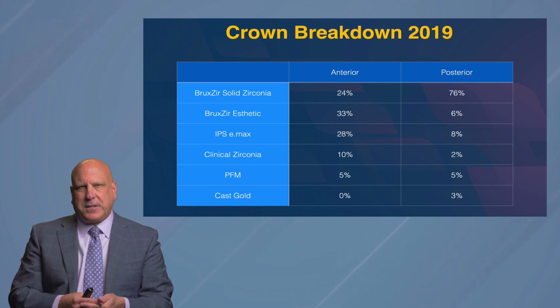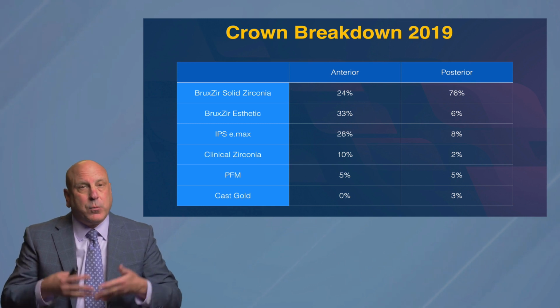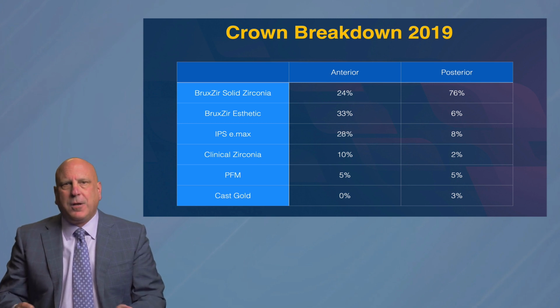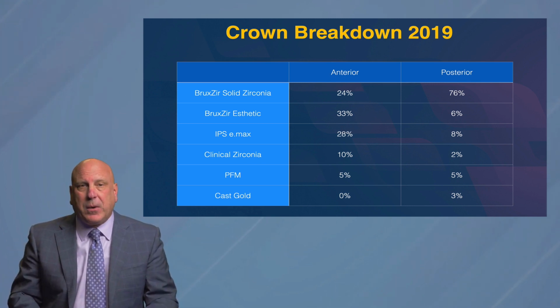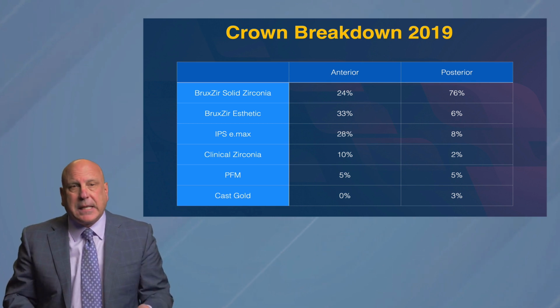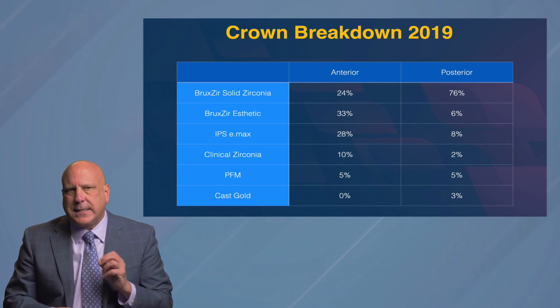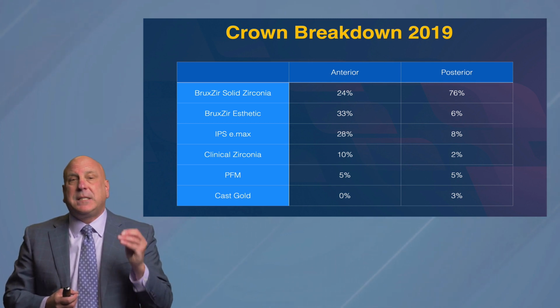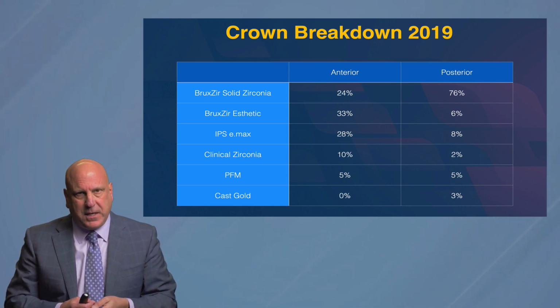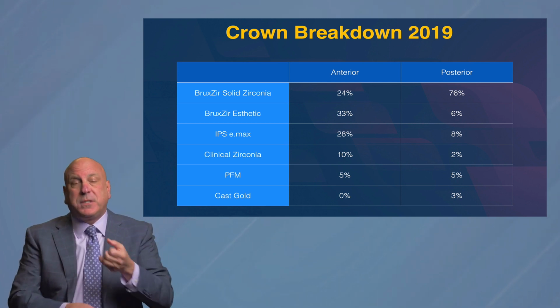You're asking yourselves, as we look at these numbers, what is the message that dentists have received and what are dentists thinking? Dentists always love to see what other dentists are prescribing, what they're using, what their preps look like, what their impressions look like. So here's a glimpse into the largest lab in the country, who works with dentists in all 50 states. And 24% of the full strength solid zirconia crowns being done are on anterior teeth. It's a curious choice because we don't need that much strength in the anterior. The biting forces in the anterior are literally 1/3 of what they are in the posterior.